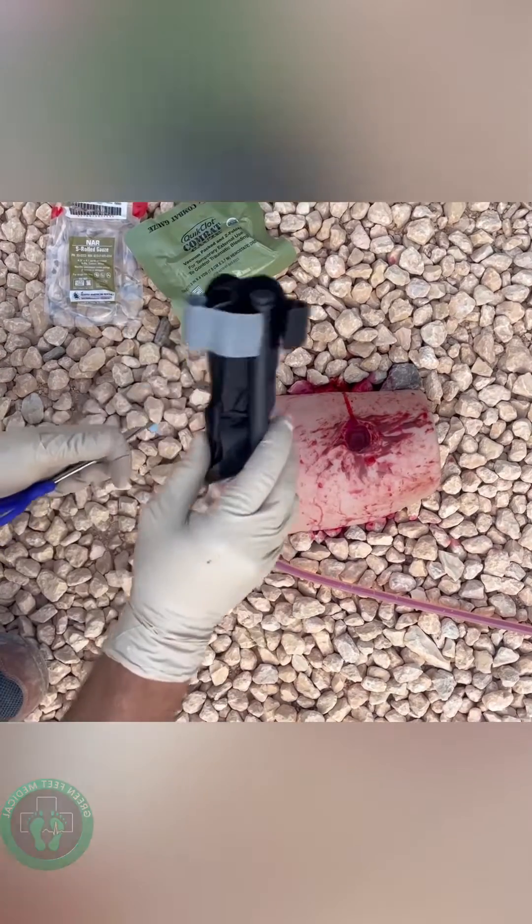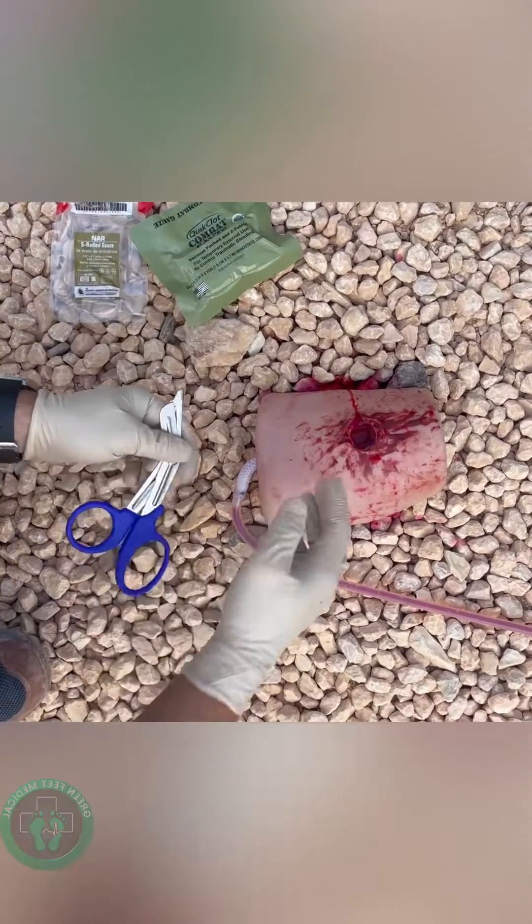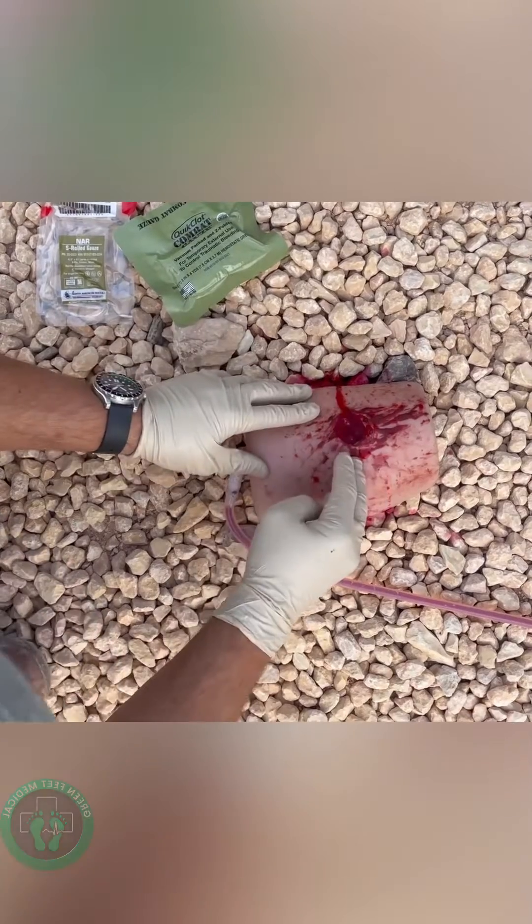So you have an arterial bleed that's not amenable to a tourniquet. What you want to do is expose the wound first to actually see what you're dealing with. So you're going to want to carry some shears with you. Once you've done that, I've found the wound.